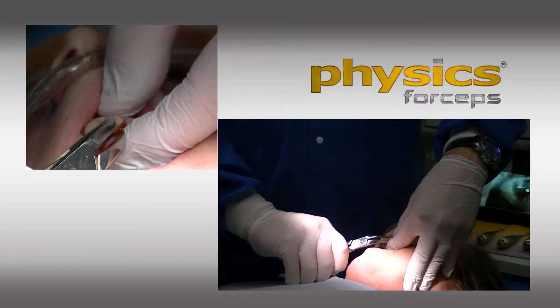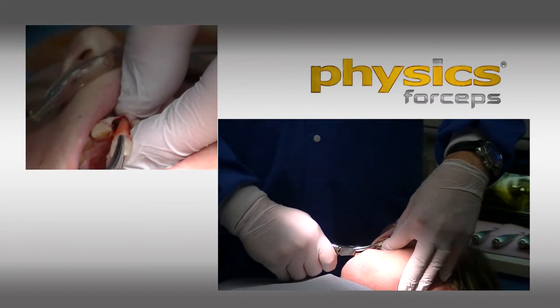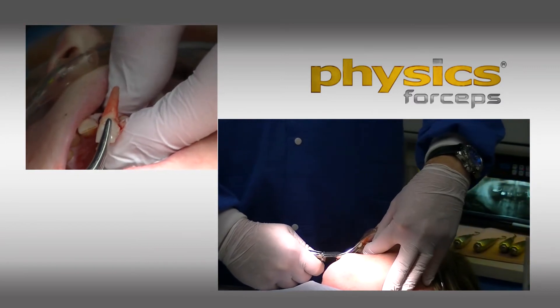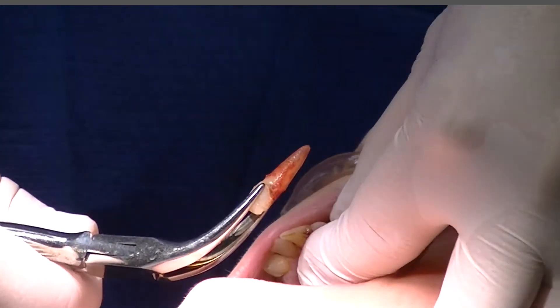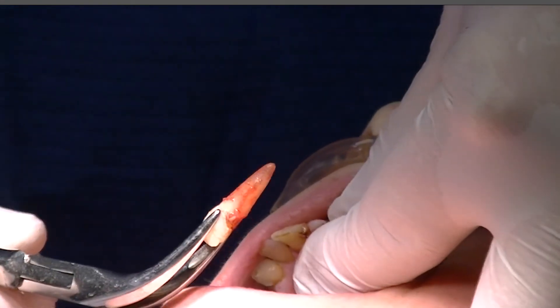I'm just simply rotating. And look at the length of that tooth — that's got to be an inch long. And the buccal plate is totally intact. Just an amazing extraction.